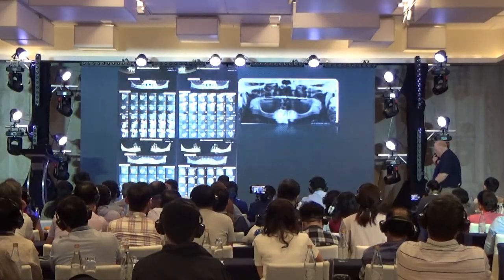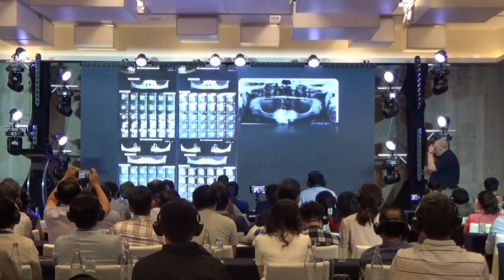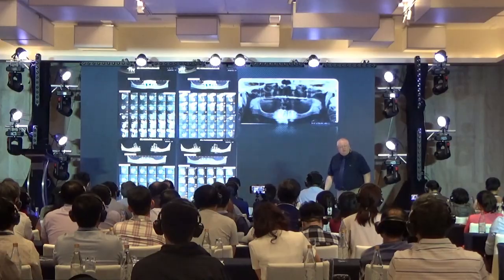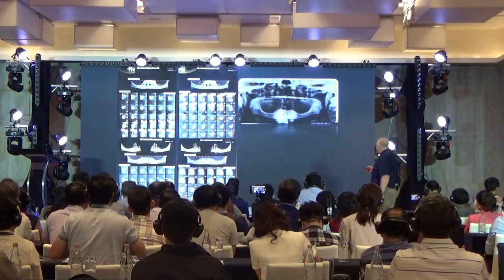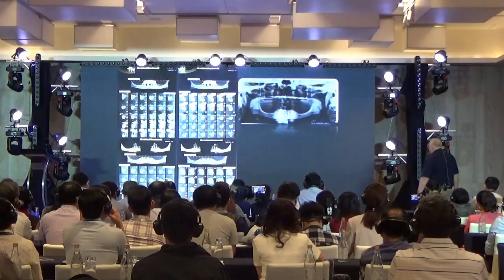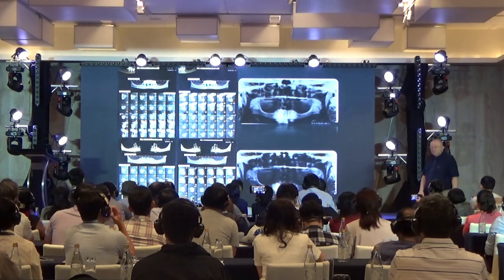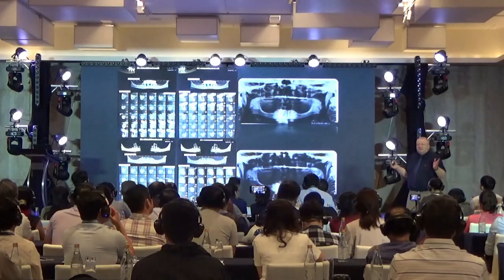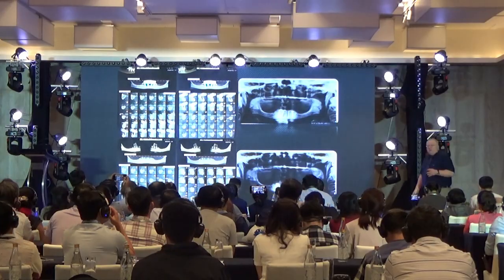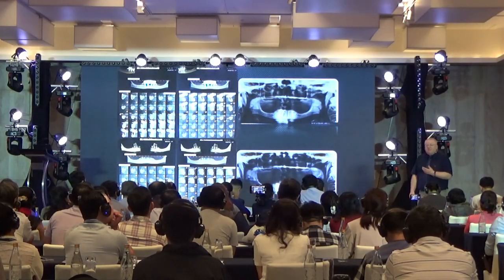This is a funny case. This patient, unfortunately, had Alzheimer's. So as you see here, again, as I told you, most of the cases are implant failures. She came with this picture, and then we did the same procedure, and we placed 4 implants. And then she disappeared. After 2 years, she comes back. She says, "Doctor, when are you going to place these implants?"